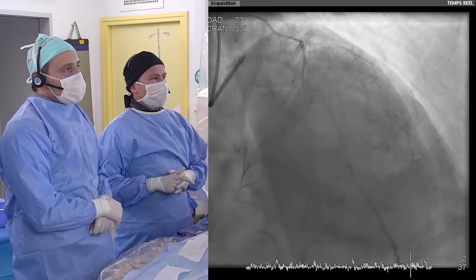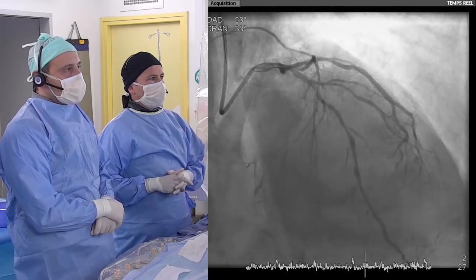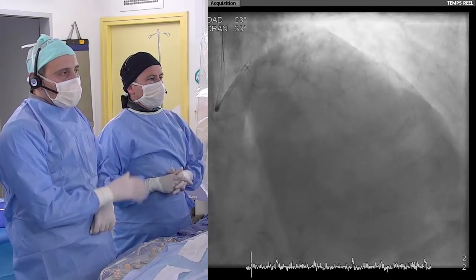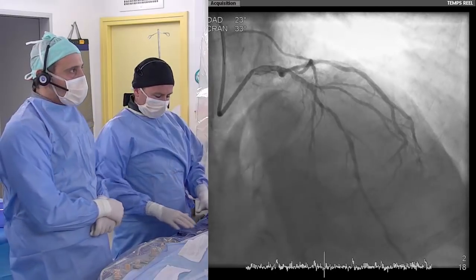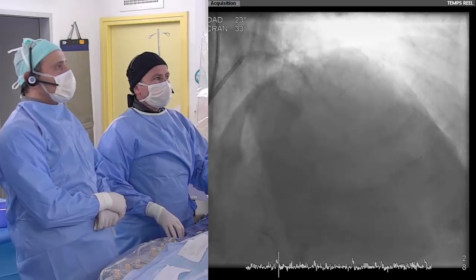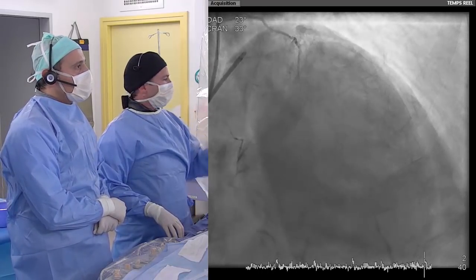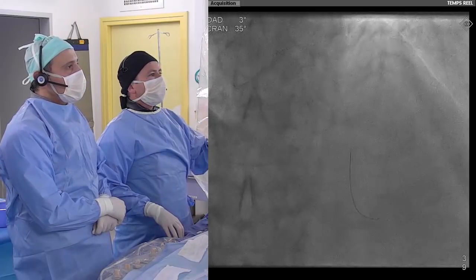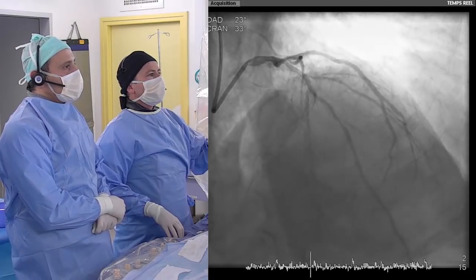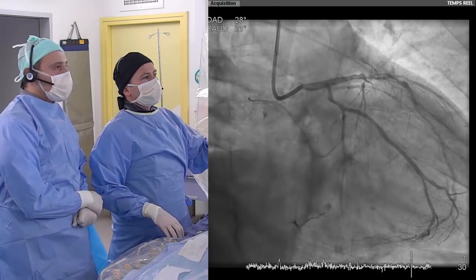There is also a disease at the ostium of the LAD as well that we might need to discuss and assess, but it's really a long diffuse calcified left anterior descending artery. If there is any comment from you, interrupt us at any moment during this angiogram. Do we have other projection, Nicolas? Yeah. What we did, perhaps you can just inform on what we have done so far.